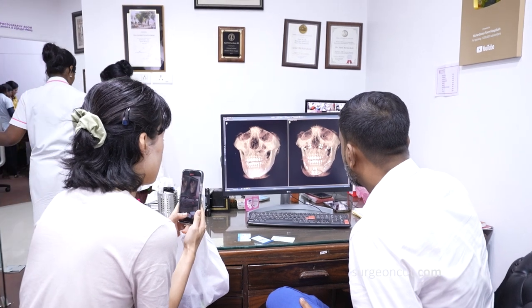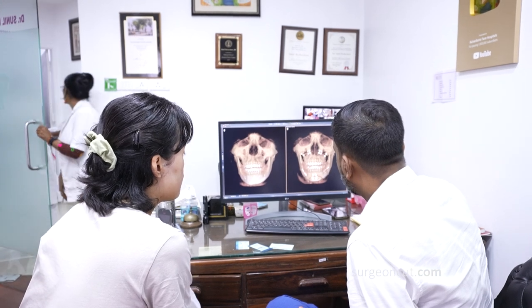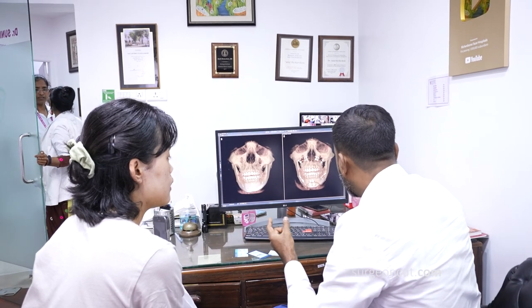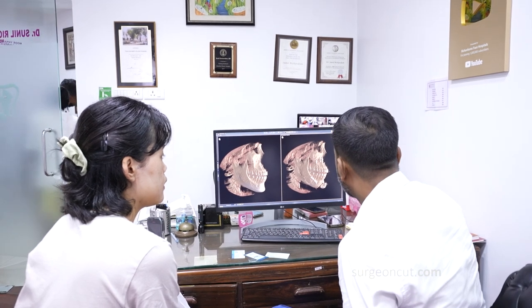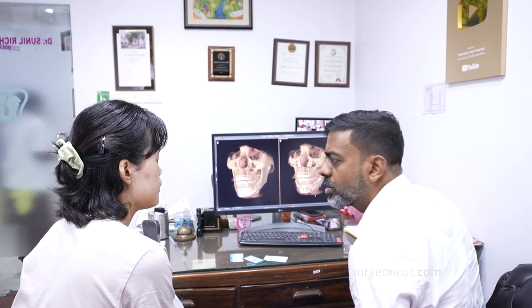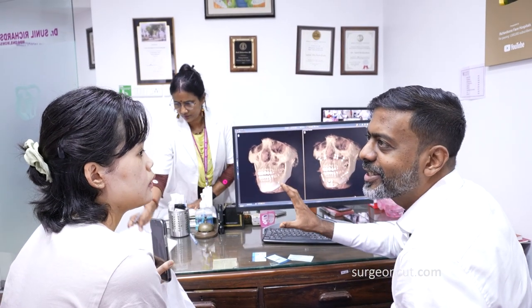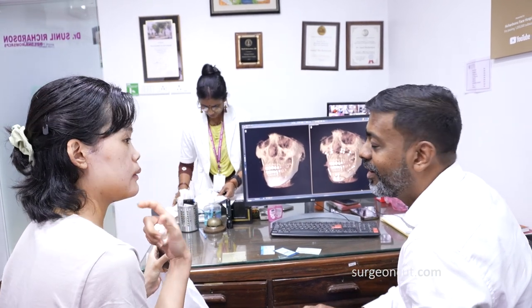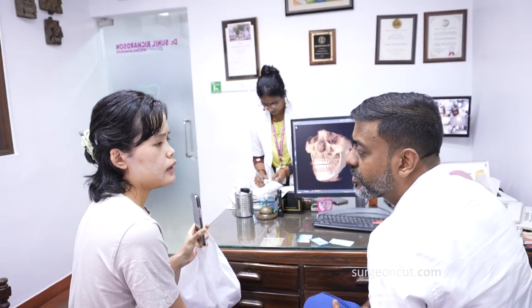Then on the lower jaw, you have one plate here with four screws. Yeah, you can take a picture. We will give you the scan also. One plate with four screws here, another with four screws there. And then two plates in the chin here. Two plates, four screws, two plates, eight screws. So 4 plates and 12 screws. So 8 plates and 24 screws you're having in your face now. So it will stay whole life? Yes, nothing will happen. These are very good quality plates and screws.